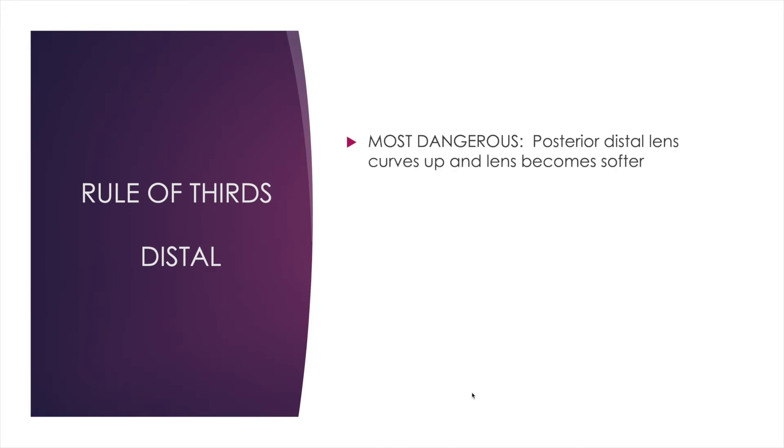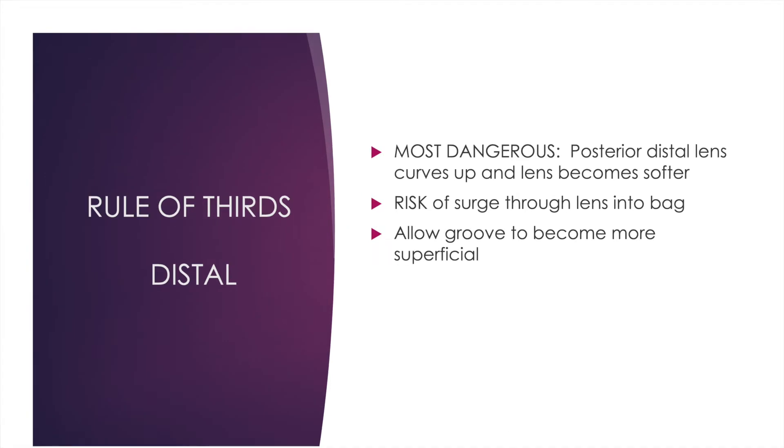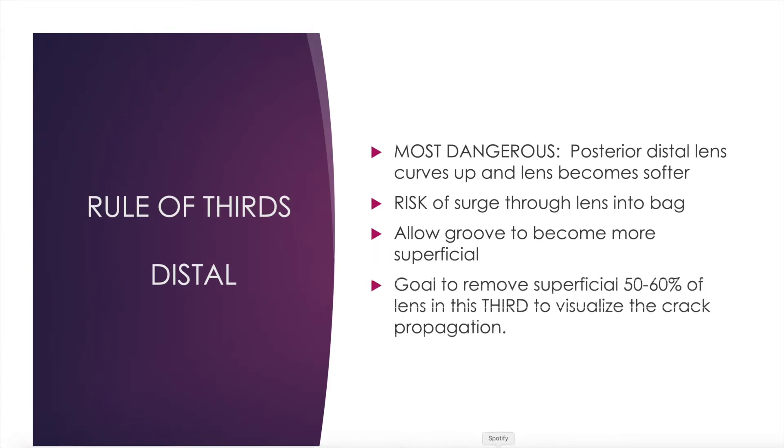I use the most caution in sculpting the distal third, as I'm concerned I'll burst through and break the capsular bag. The lens becomes less dense in this area and the posterior lens curves upward as well, so I'm really only trying to remove about 50% of the superficial area, just so I can best visualize when I go to crack.